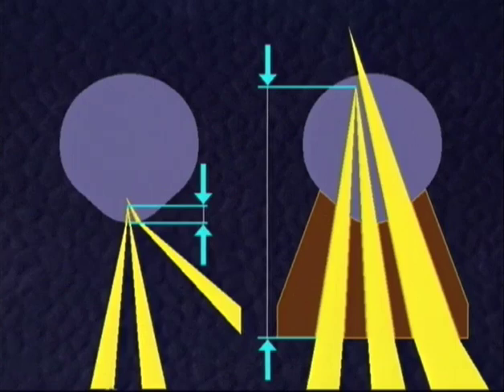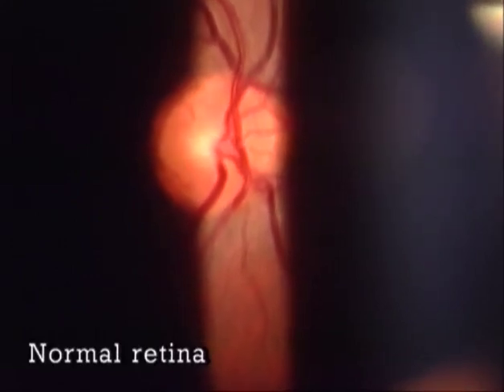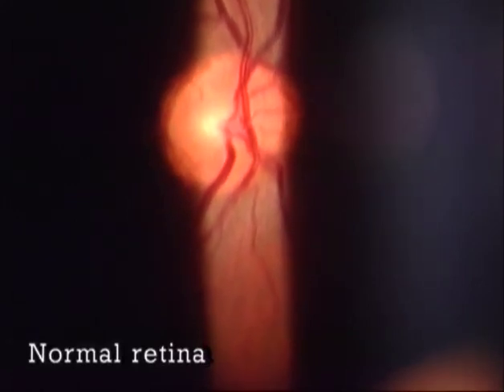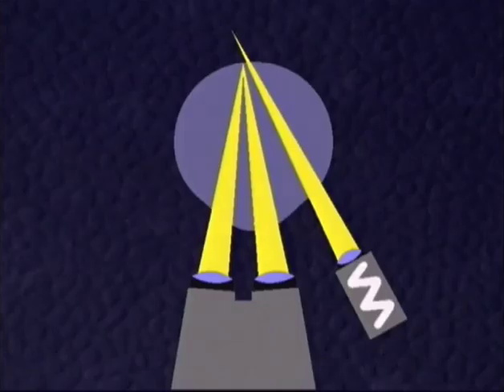How can the loss of coincidence of focus be recognized? This is shown here at the fundus. The retina has been sharply focused at the point of observation. The slit light, however, does not appear sharp, and despite all attempts it cannot be made narrow. This proves that the coincidence of focus is lost. To re-establish coincidence of focus, the rays of the slit beam must be refocused.